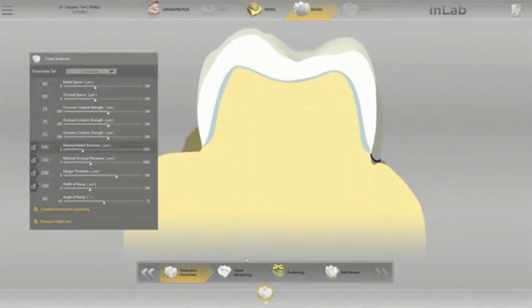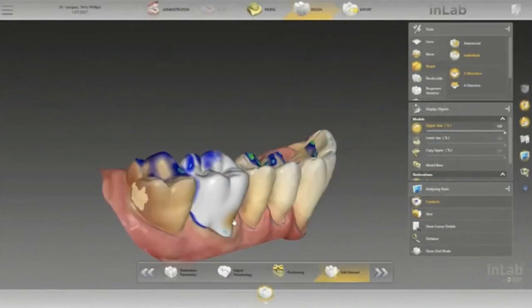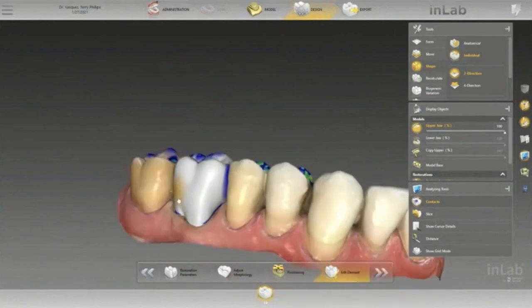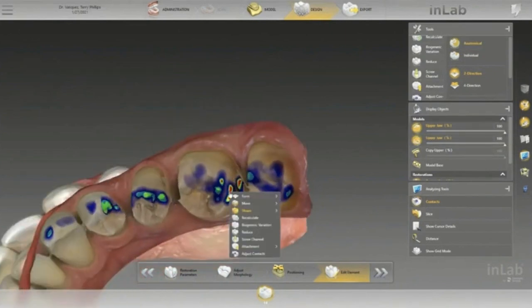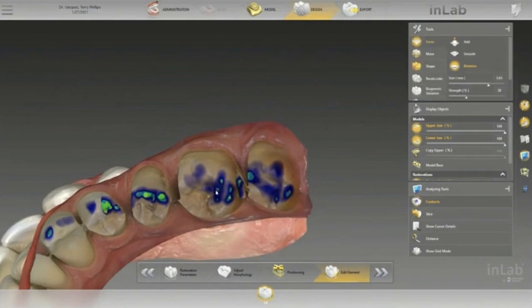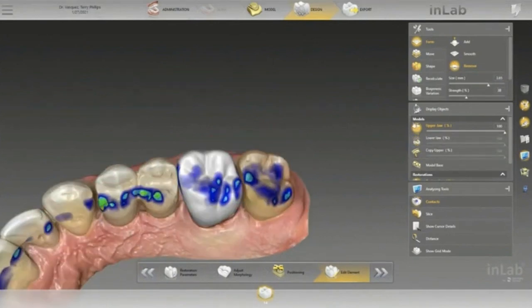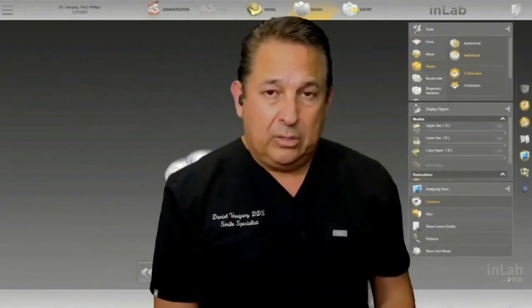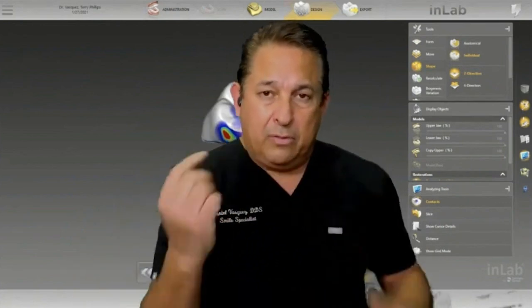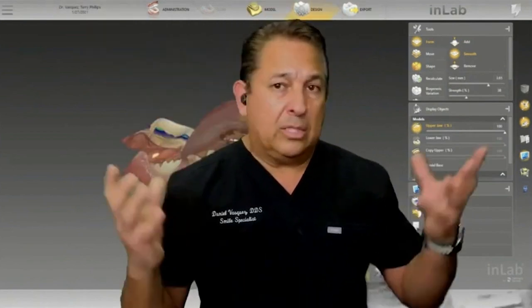Okay, here what I'm going to do, it's so simple. The software is going to do everything for you. Chairside dentistry has become extremely simple, a couple clicks here and there. But the most important thing I want to say is about the power of these new materials. But your prep is extremely important. If you're going to be prepping with a big shoulder or big chamfer, it's not going to work. You're going to have issues setting these crowns. But whenever you do this feather edge, you will have phenomenal results setting these crowns to contact occlusion.